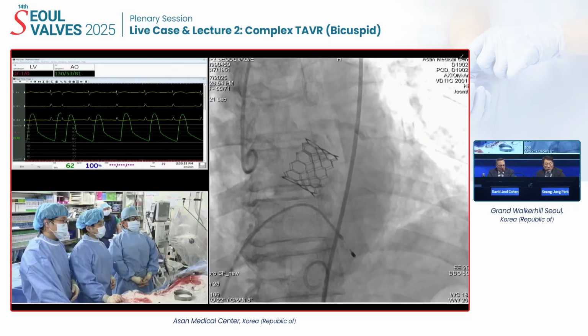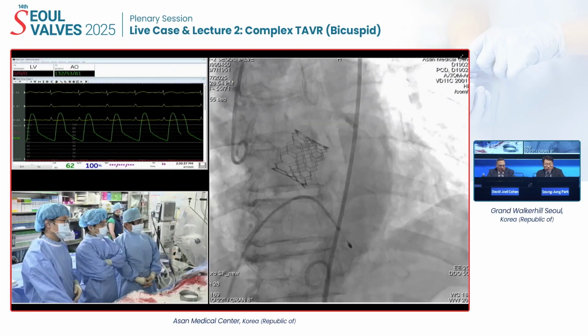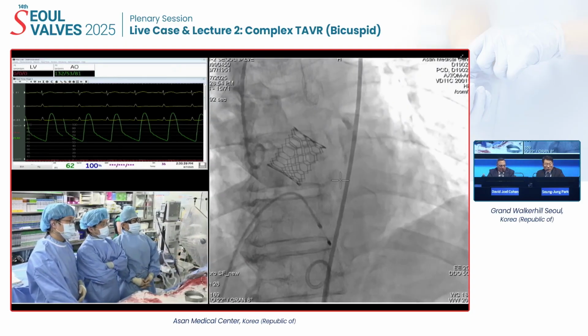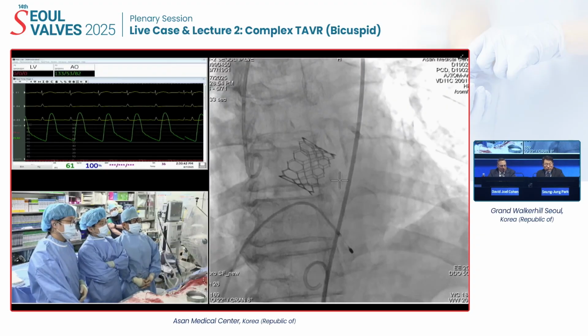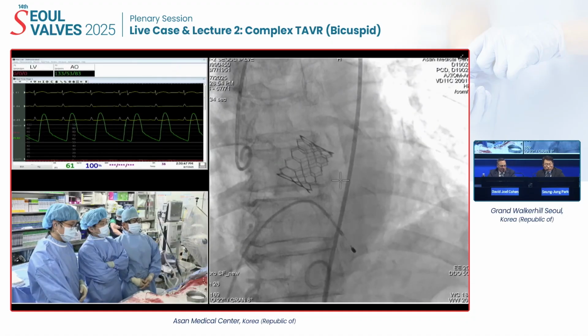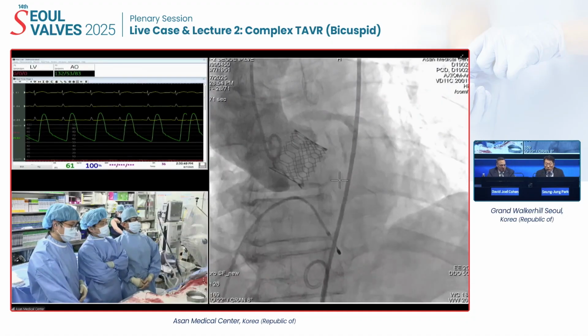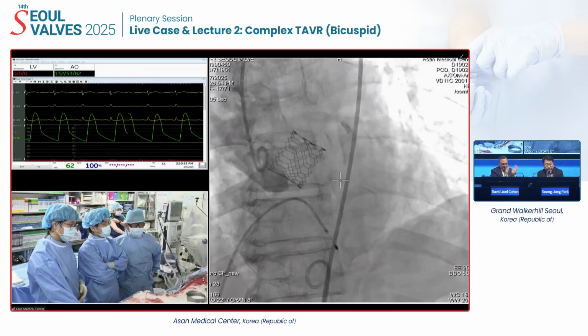That to me looks like a very beautiful result, Jung-Min. Good cases, really. We appreciate your teaching us so much about bicuspid disease, because certainly we still have a lot to learn about it, but I think you guys are masters of it. You have really made it into a science, and that's a wonderful thing. So thank you so much for a wonderful demonstration. Thank you.